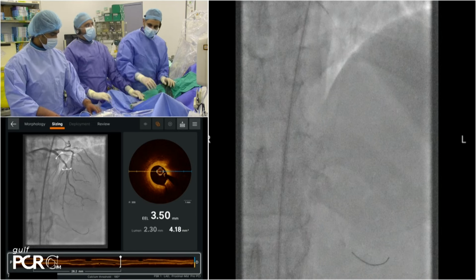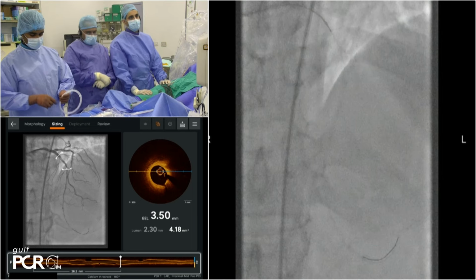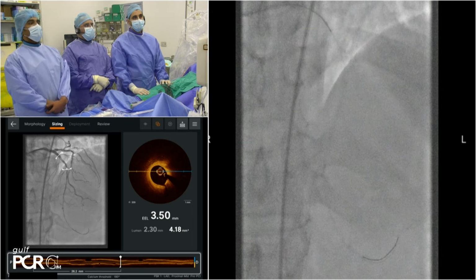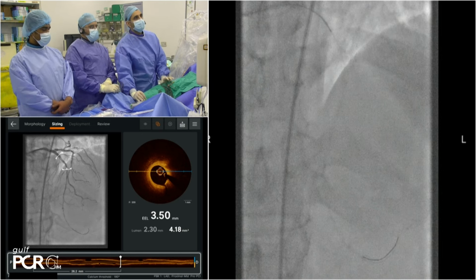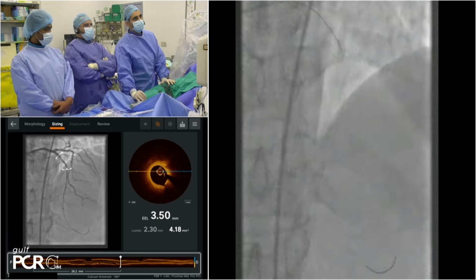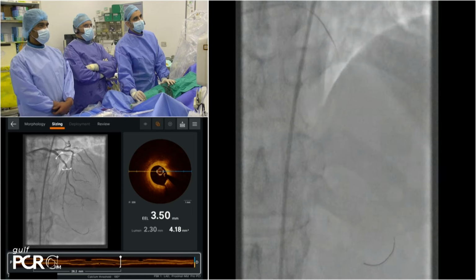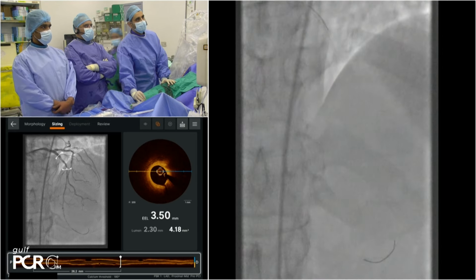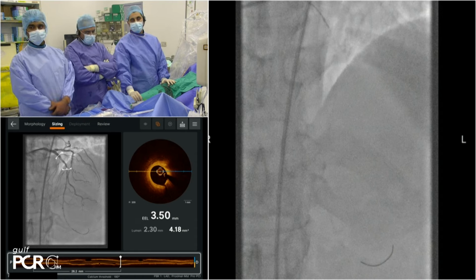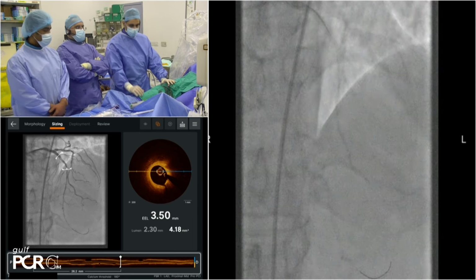As we all know, I think the biggest enemy that we have in coronary disease is calcium. It's more difficult than anything else, even more complex CTOs. With the technology that we have now, we can look into the characteristics of calcium, whether it's concentric, superficial, deep, and if it's a nodule. And many of the labs around the region have all these tools to manage it. One caveat that I have is, especially with a calcified nodule, if you take a non-compliant balloon and try to crack it with high pressure, you get into perforations really easily, because the edge of the nodule and the shoulders are the areas with the least resistance, and you actually rupture it pretty easily. I certainly had some of those cases before, and I respect nodules much more than even concentric calcium.